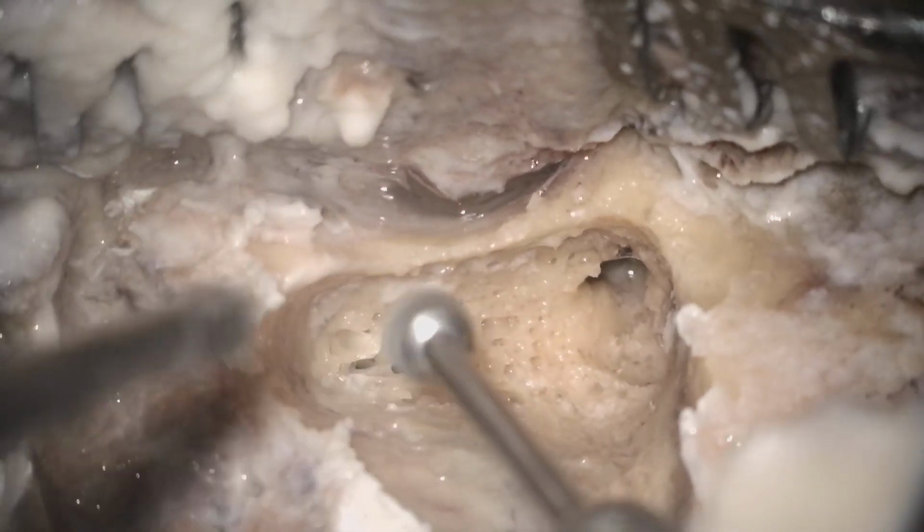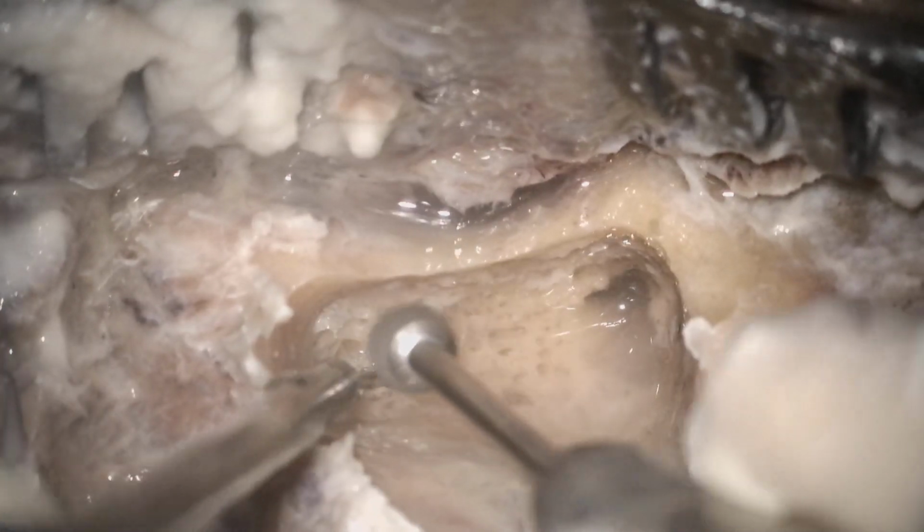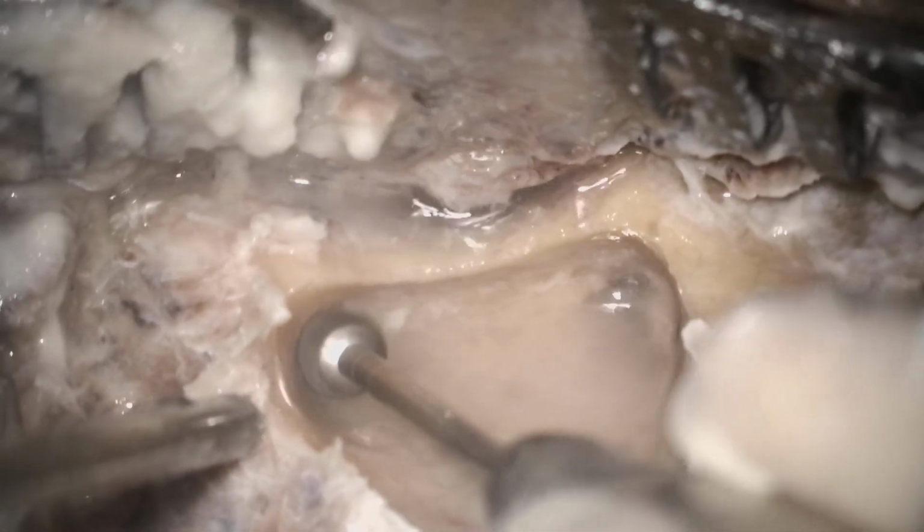Hello, sir. Yes, yes. Tell me. How can we identify the digastric ridge? Yes, I will just show you how to identify. You will just drill the tip cell bone. Whenever you have completed the lateral tip cell bone and you are going to the medial tip cell area, when you really drill all the bones over the tip cell, you can directly identify the digastric ridge, because you don't have to drill or make the digastric ridge. It will appear on its own.